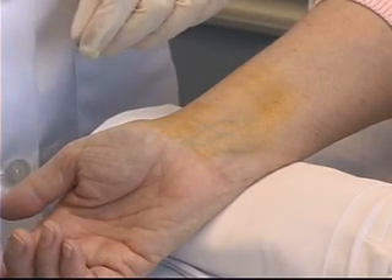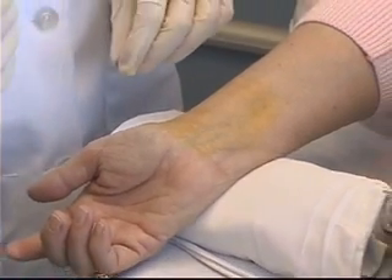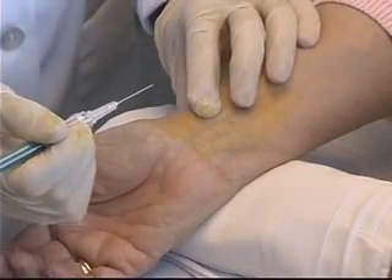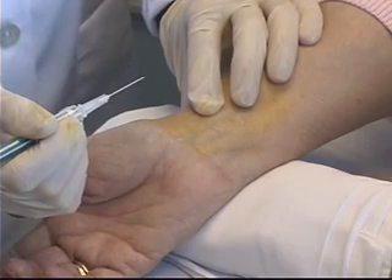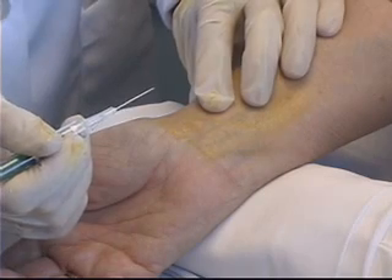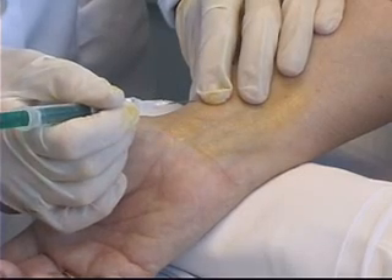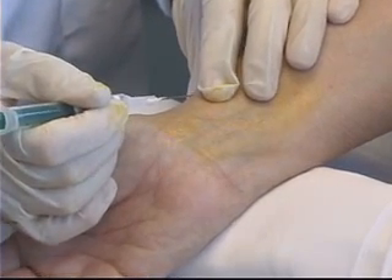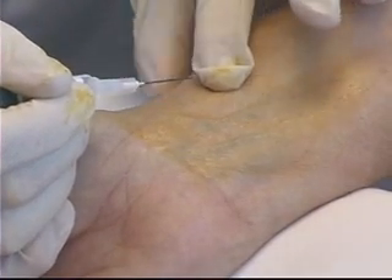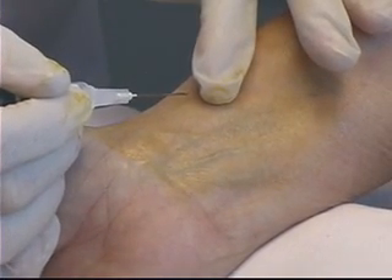I'm going to hold the syringe a little differently for the blood gas procedure — at a sharper angle, closer to 45 degrees — and hold it much like a dart or a pen. I'm going to feel for that pulse, as that is truly my only landmark for knowing where to break the skin with this needle. I've got my needle right there, ready to go in. The last thing I do before going through the skin is roll my finger back a little bit out of the way, and now I can put the needle into the skin.